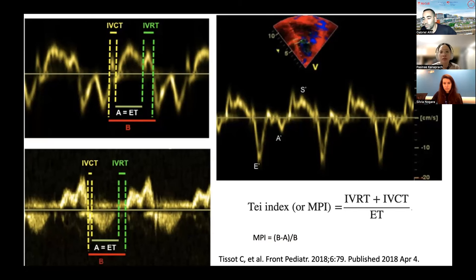It's mostly something that I use in research to see if there are subtle differences, because I'm not so sure that clinically it's able to depict subtle changes that will be meaningful for our patient population, but that I don't know. That's why we need to do research to quantify and then see if there are markers that are more sensitive to detect certain disease states and that are associated with meaningful outcomes.